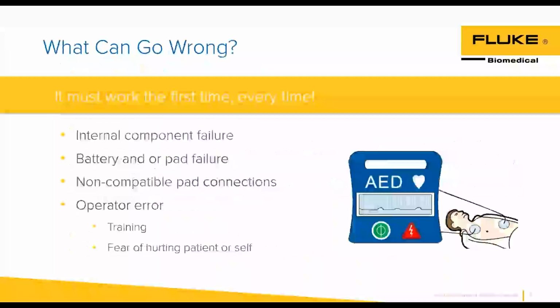So what can go wrong with all these devices? There's some general categories here: internal component failures, battery or pad failure, non-compatible pad connections. Hey, this happens a lot. And you're going to say, well, how is this my responsibility? As a biomed, we want to make sure that patients have the best experience possible, right? The best outcome. So what can happen here with these pad connections is if you have an AED out there, right? You don't control the AEDs. They're at shopping malls. They might be in the back of a cop car or in a fire truck or wherever that AED is at. Somebody else bought that AED.